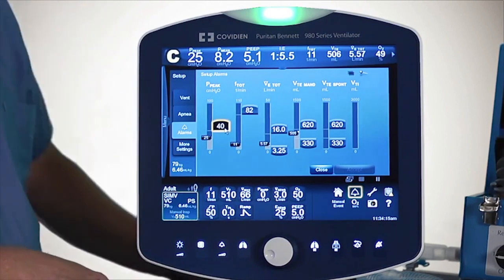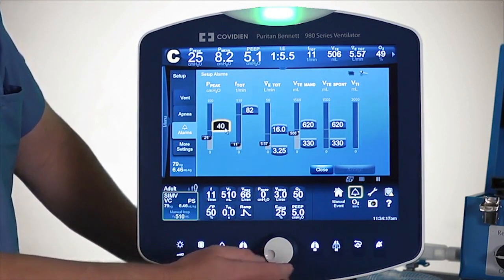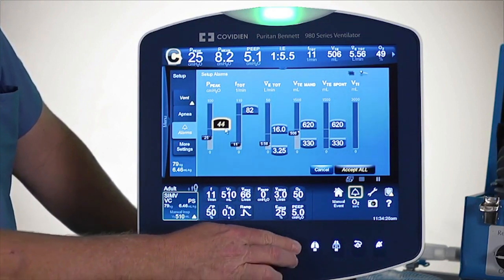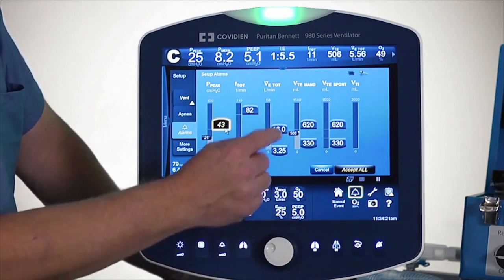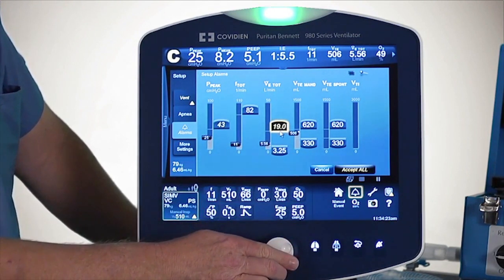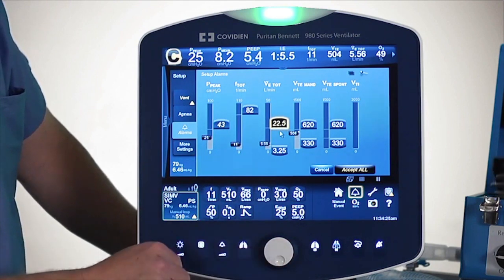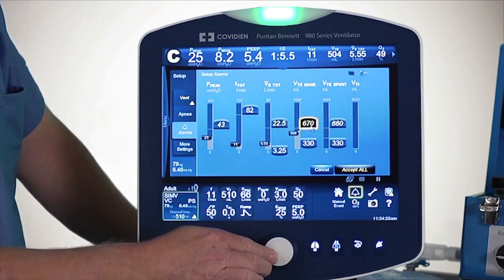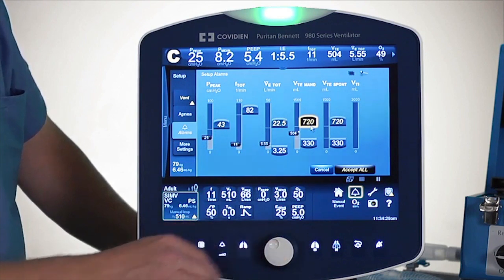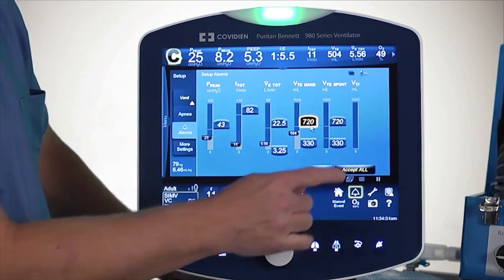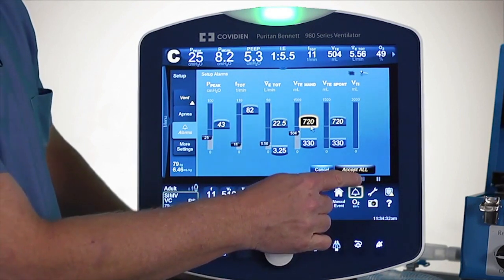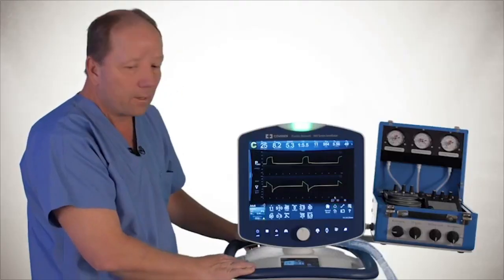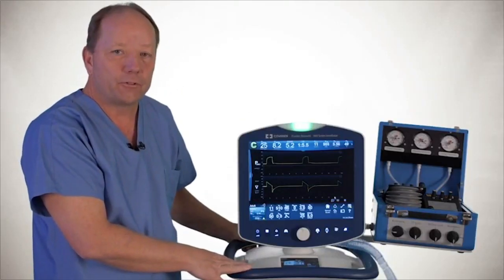To adjust any of these, I simply touch the parameter and use the knob to adjust it. Each time I select an alarm, I just use the knob to adjust it, and then my last step is always to press accept.